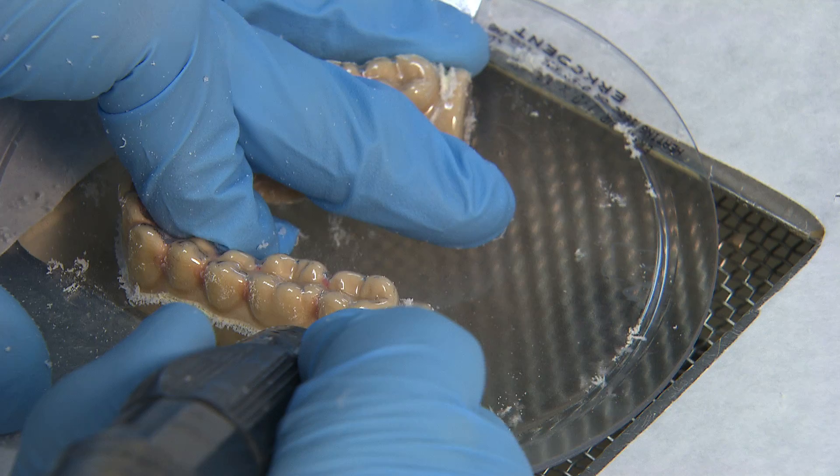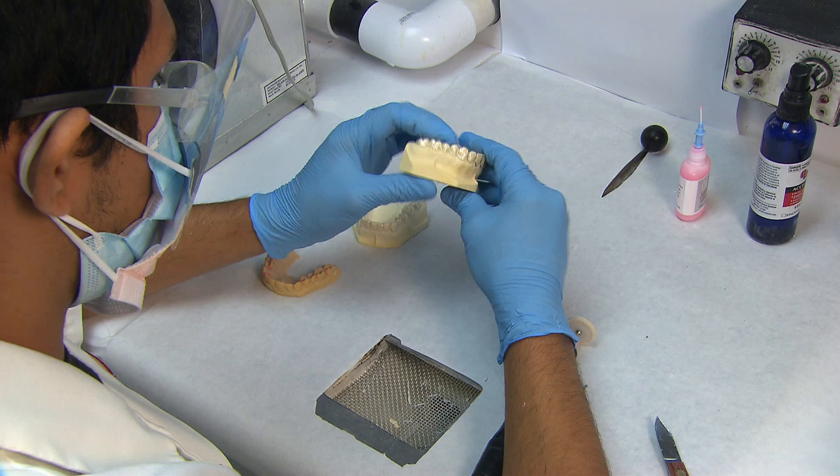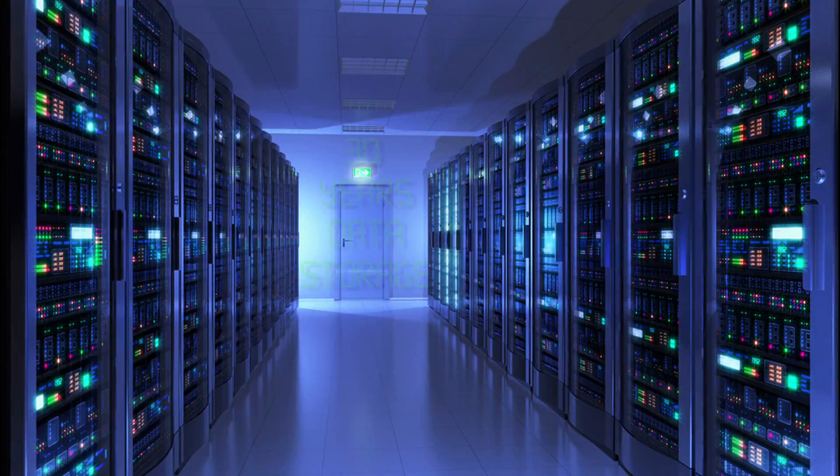Once it cools, a low-speed handpiece and a fissure burr is used to cut the appliance from the model. Then the edges of the freed appliance are cleaned up and smoothed with a tungsten carbide burr, adjusted and eventually polished. Quality control personnel review the device and then it's shipped out to the customer.